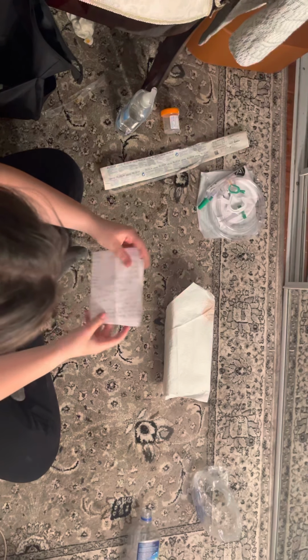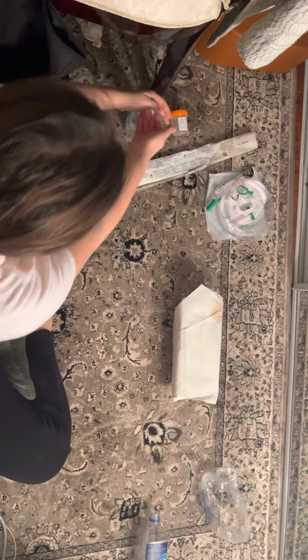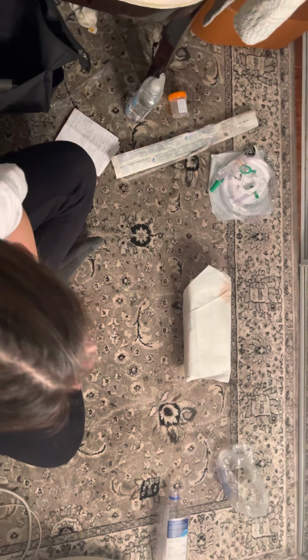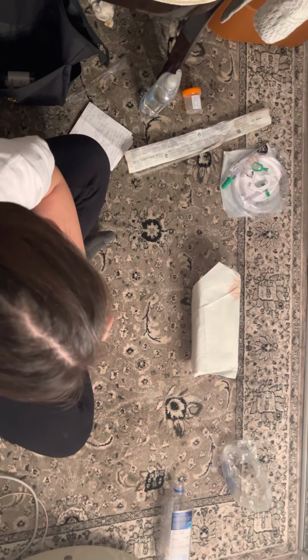I'm going to begin by reviewing the prescription. So, hi, my name is Isabel Shell. I'll be your student nurse for today. I'll be inserting a urinary catheter. It will involve a little bit of touching. Is that okay with you?